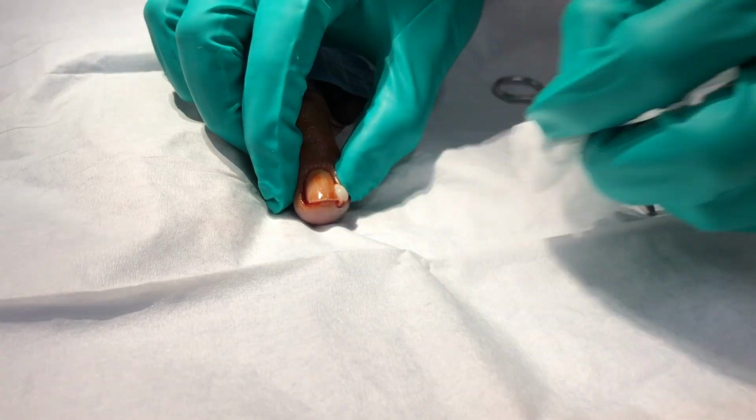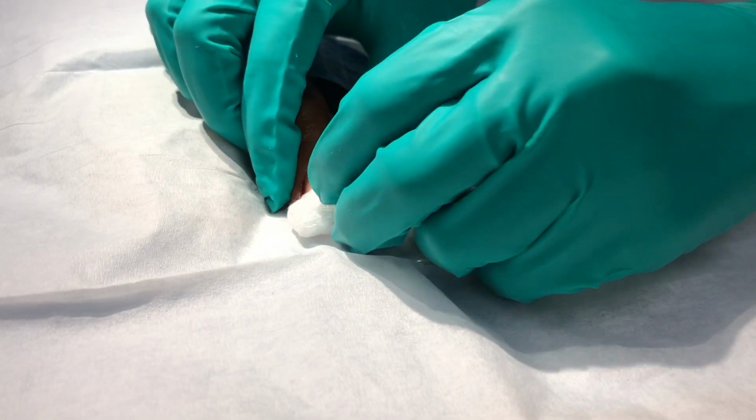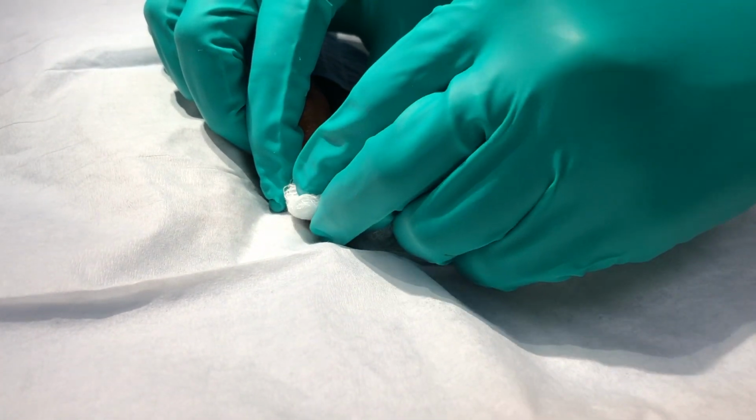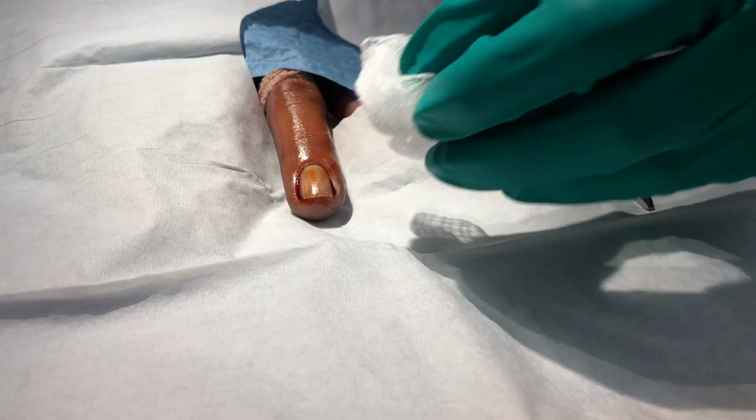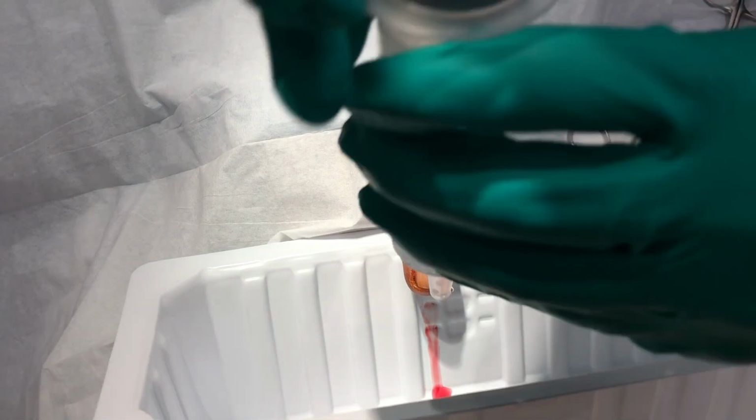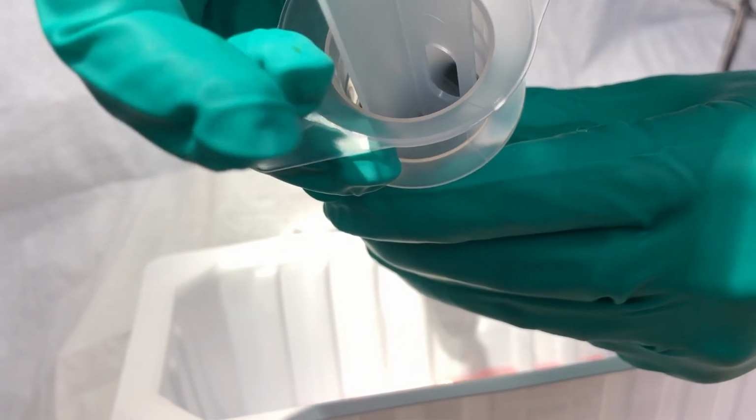In this video, a single incision is adequate to drain this simple paronychia. However, in cases where the infection extends below the nail, incision and elevation of the nail might also be necessary. The area is irrigated with sterile solution.